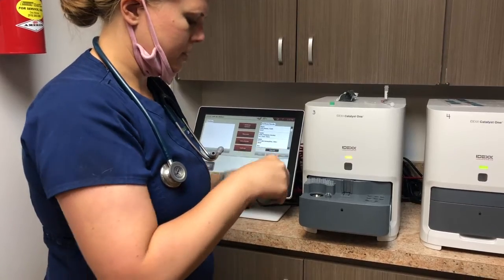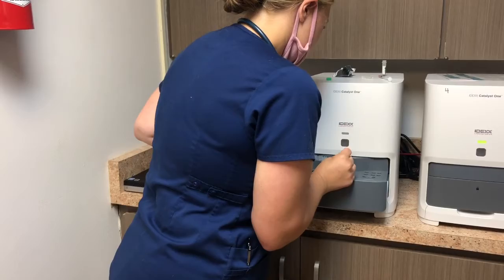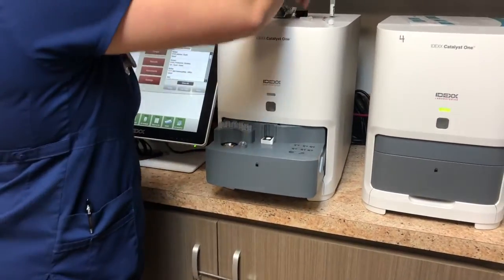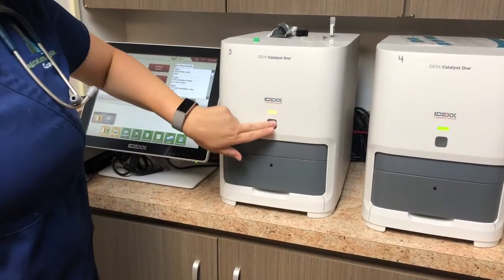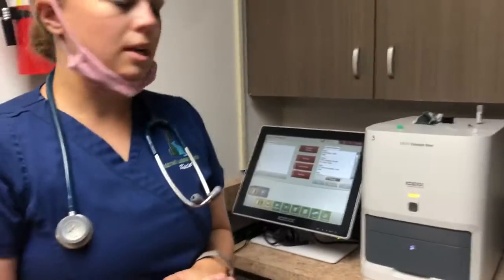And I'm then going to insert here. I'm going to close this then once we've got all of our samples needed. Press the button. My sample's already been ordered, so it's going to start running the timer, and then we'll come back and look at the results.